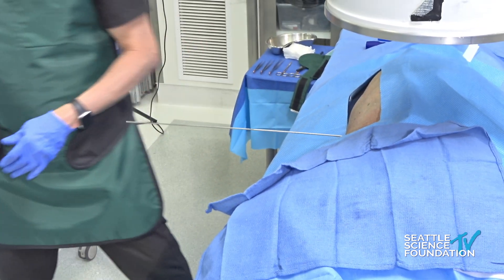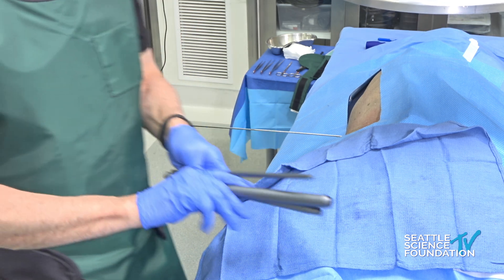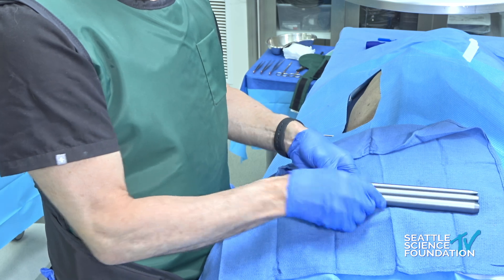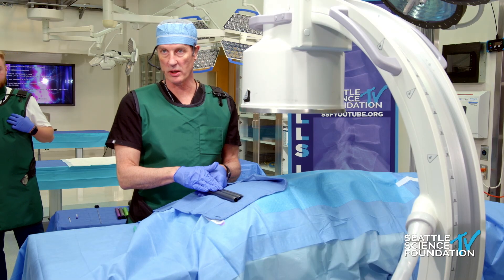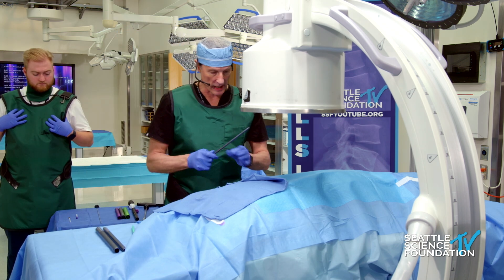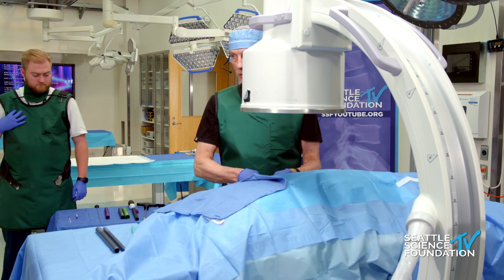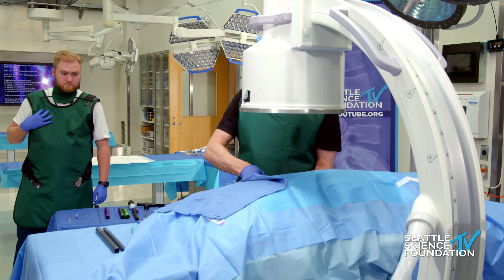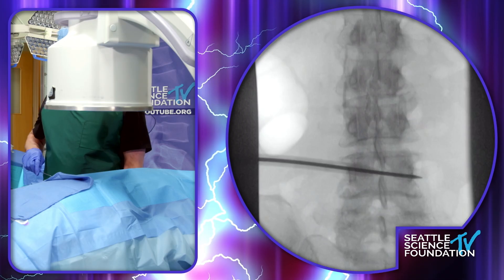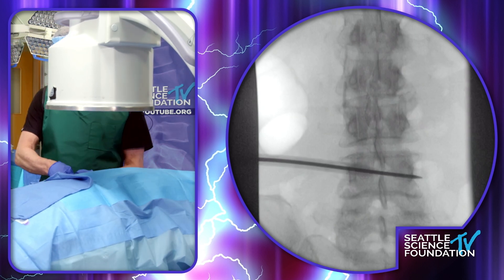As you put that introducer across, you cross the interspinous space. Did you bump up against the hypertrophic facet on the far side and then climb over the top? So, prior to this, we're going to dilate up. The only incisions that we make are on the skin, and the rest of it is all the way through a dilation process through the 2-centimeter incision. We're going to go all the way up to the spinous processes, and commonly you will be able to get to the spinous processes. But the rest of the dilation, sometimes we'll hit short of it because of the hypertrophic facet.